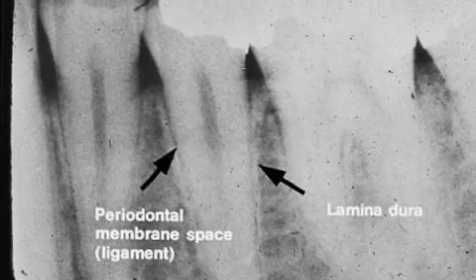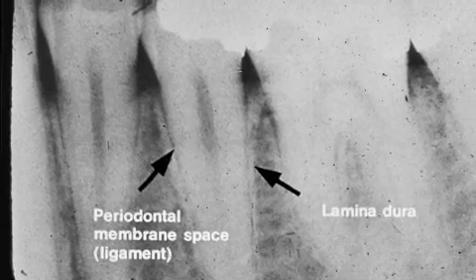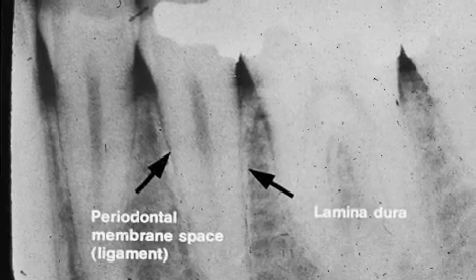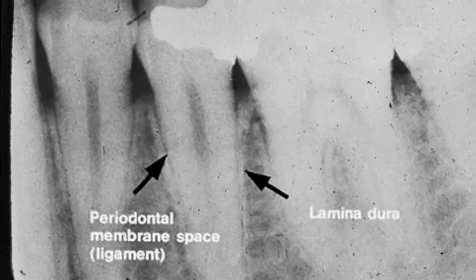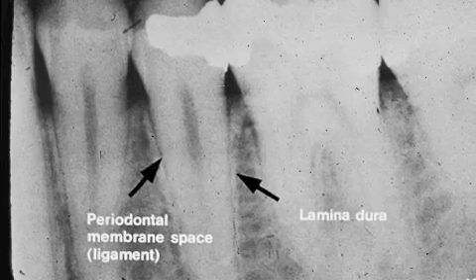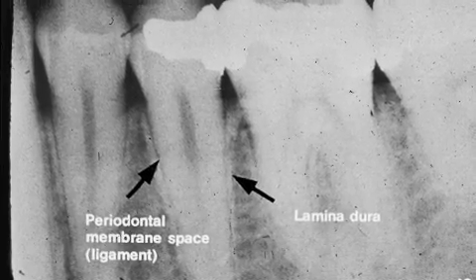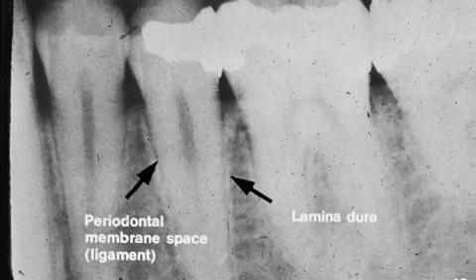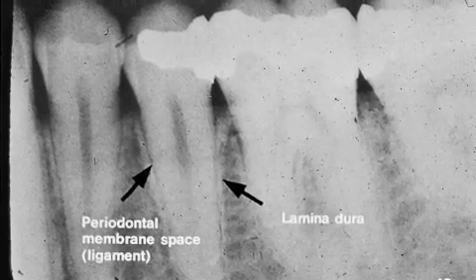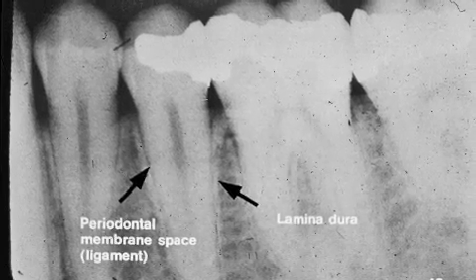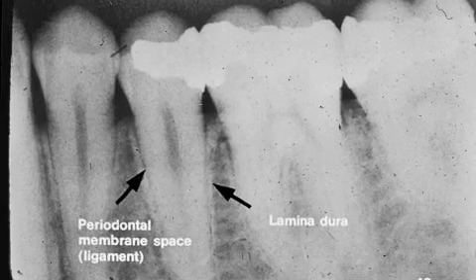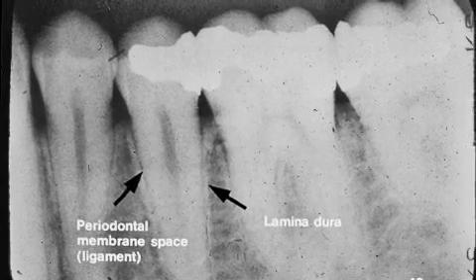The arrow on the left points to the radiolucent periodontal ligament, or periodontal membrane space. It is where the periodontal ligament attaches the tooth root to the supporting bone. The arrow on the right points to the lamina dura. It is radiopaque, hard, compact, cortical bone that forms the tooth socket.